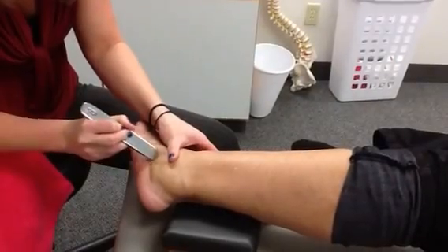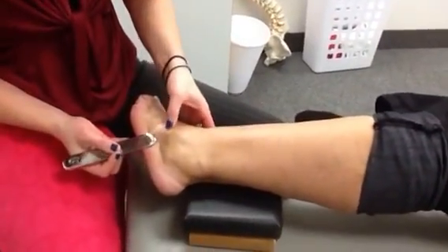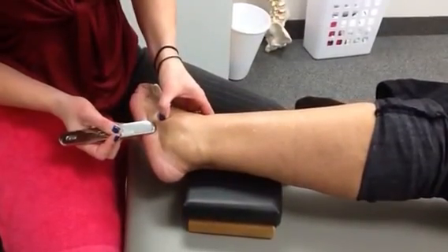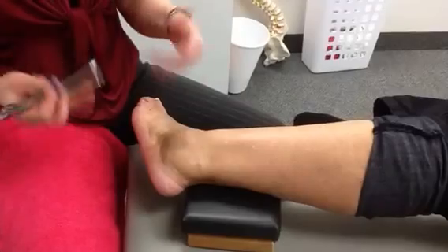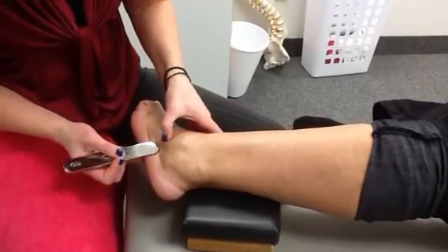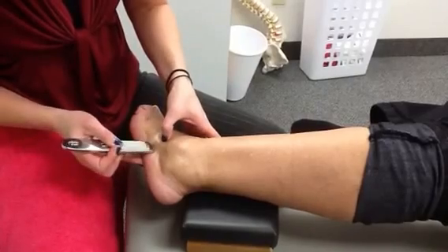So basically we would do this, just kind of loosening up the surrounding tissues, and then we would also perform the scar release technique, where we're going to try and bring the tool under the scar and lift the tissue away from the underlying tissues. Lift the skin from the underlying tissues. And this was repeated for, not too long.